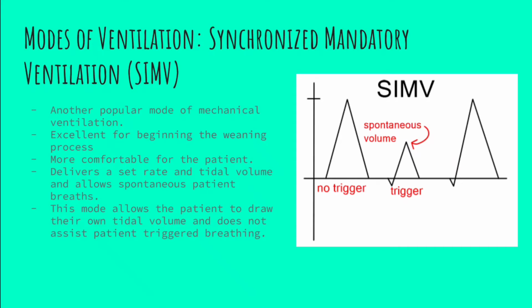the patient to take their own triggered breaths without having the ventilator stack the full tidal volume on top of it. So whatever the patient draws in on their own, under their own power, is what they're going to receive. So in a lot of cases, this is more comfortable. Now, what the ventilator also does is if a patient's taking a breath and there's a scheduled breath right after it, it's going to try to synchronize those breaths so that we're not going to end up with an issue where the ventilator delivers a breath on top of the breath that the patient just took. So for safety and for comfort, this is an excellent mode of ventilation.